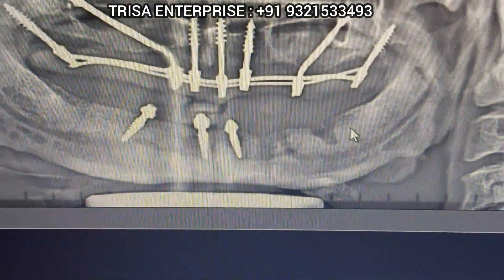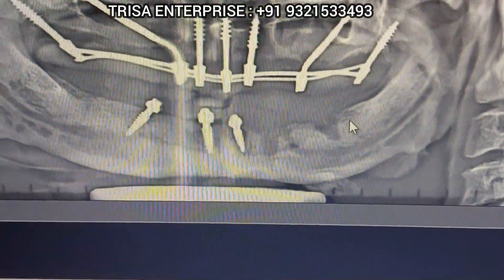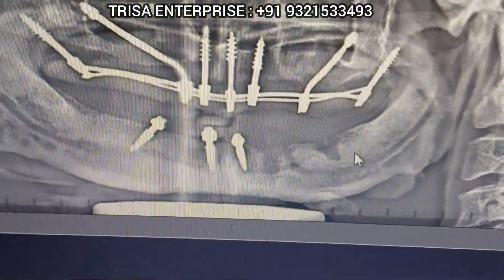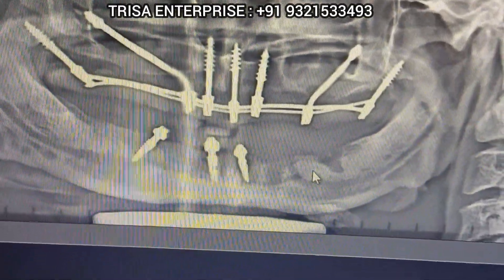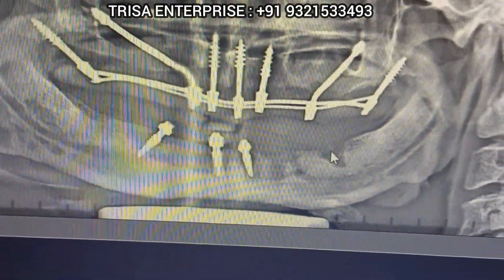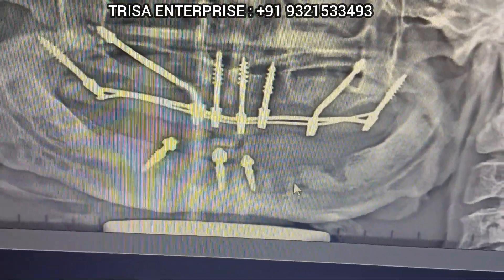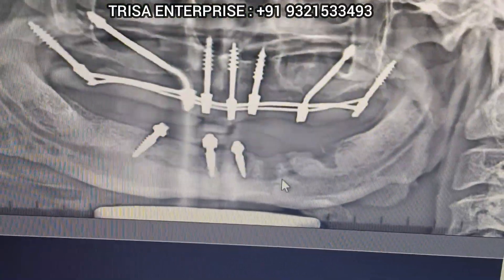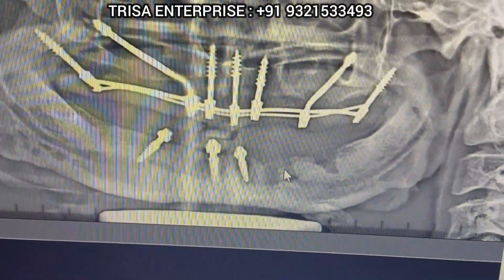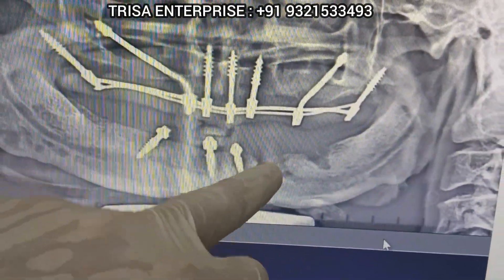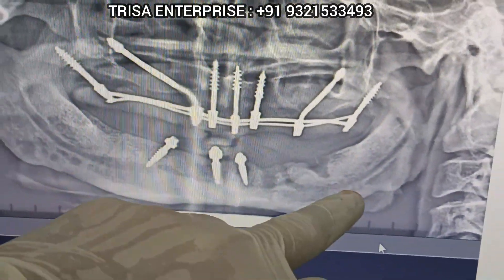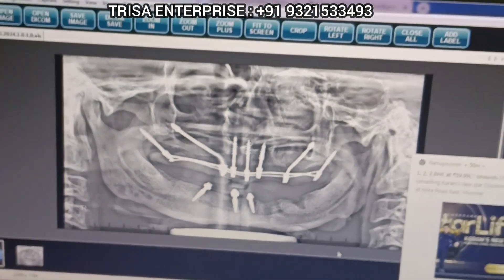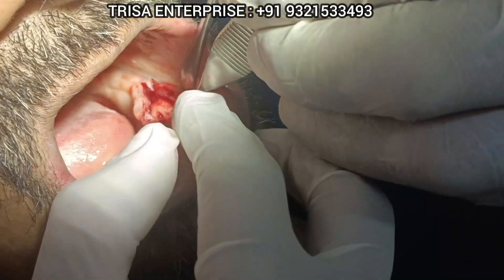I cannot go so deep in the mouth because his mouth opening is less. So I'm going to do the buccal bypass with the open flap approach because I don't want to end up in these rarefaction zones. I'm going to make a crestal incision and two releasing incisions, and I will show you how to do the buccal bypass.